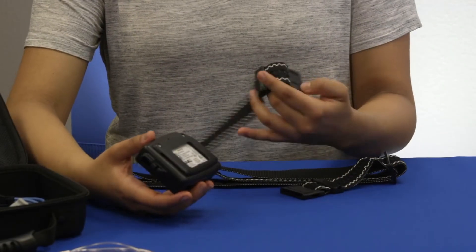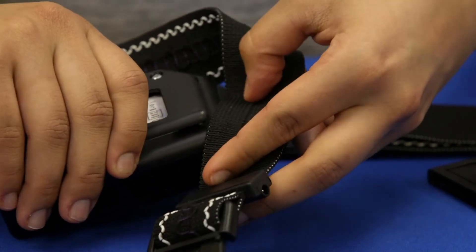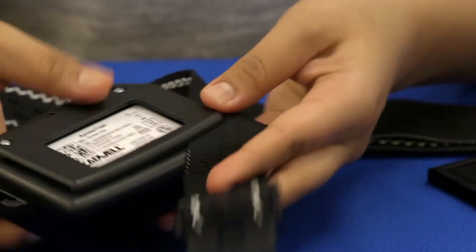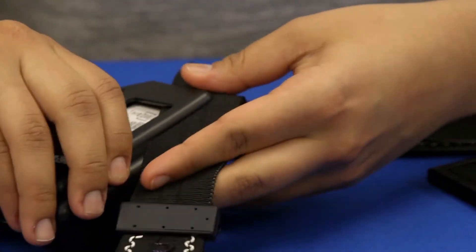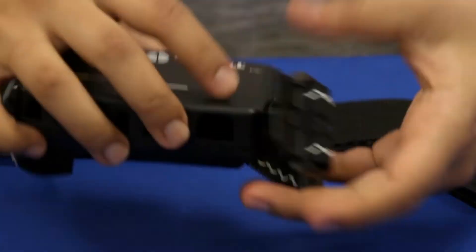Orient the chest belt so that the black input jacks face down. Orient the apnea track with the text facing up and connect the apnea track to the chest belt near the buckle by sliding the belt up under the clip on the back of the apnea track.